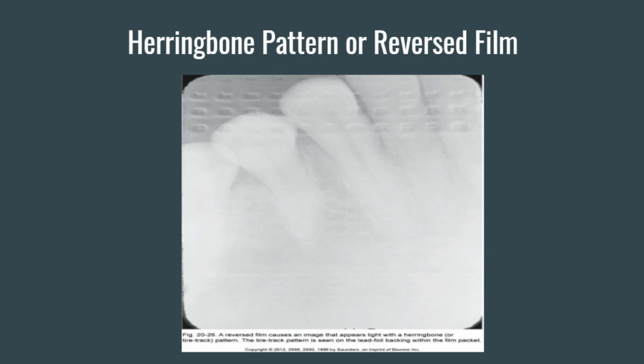So to fix this, just pay attention to how you're placing the film in the patient's mouth. There is a front and a back to the film, and just make sure you're placing it in the patient's mouth the correct way.